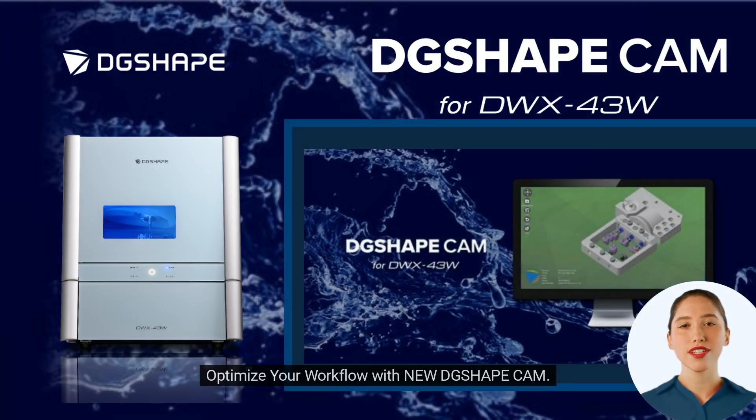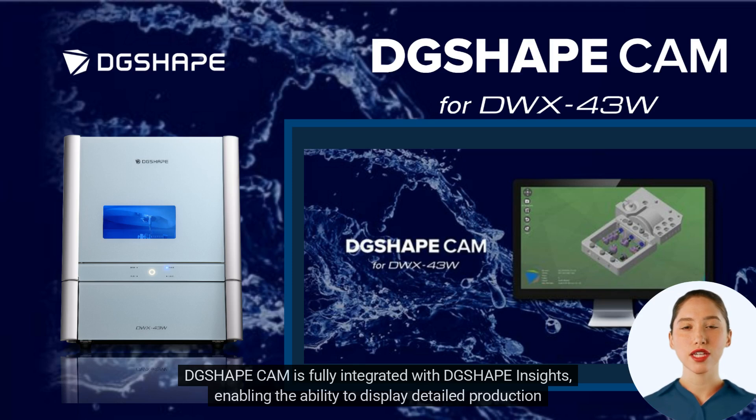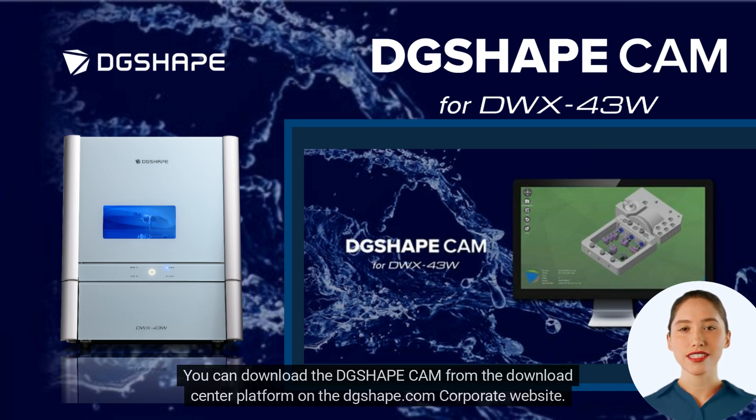Optimize your workflow with the new DG ShapeCam. DG ShapeCam software enables users to select a workflow customized to the needs of their dental business, with both standard and fast strategy modes available. DG ShapeCam is fully integrated with DG ShapeInsights, enabling the ability to display detailed production information such as output and common materials utilized, and is designed to assist in optimizing production efficiency. You can download DG ShapeCam from the Download Center on the DGShape.com corporate website.